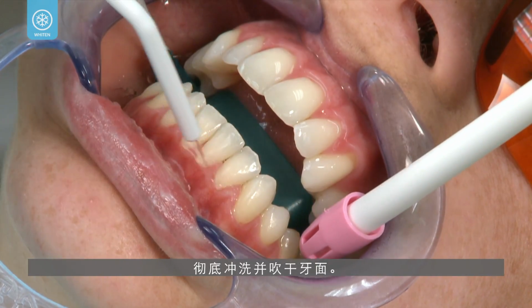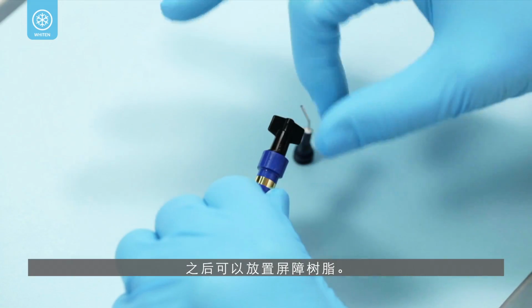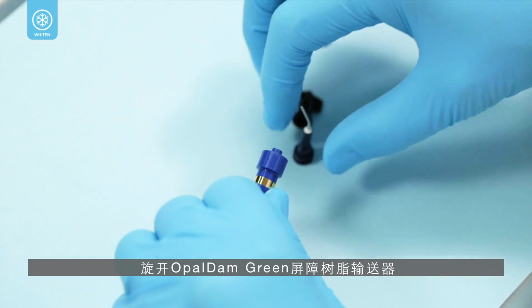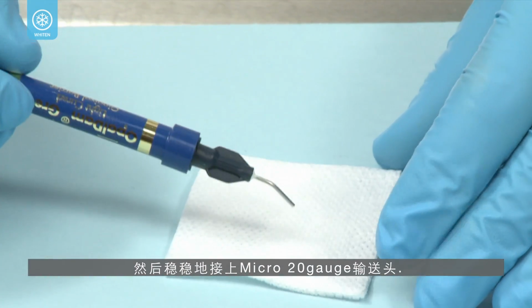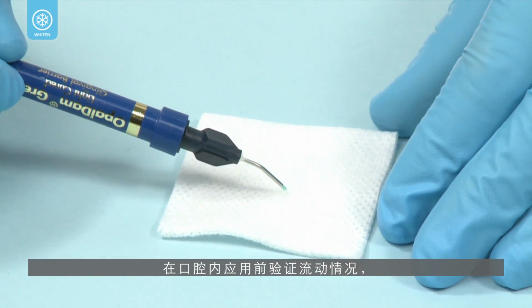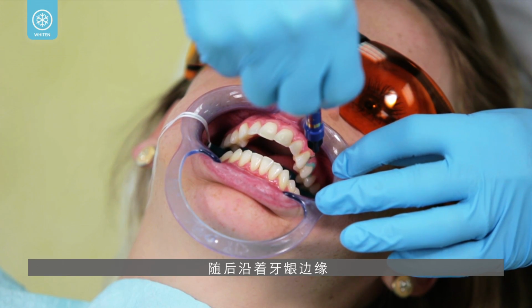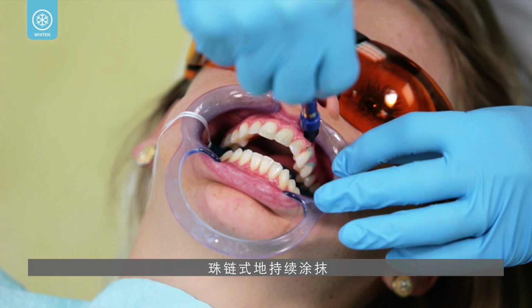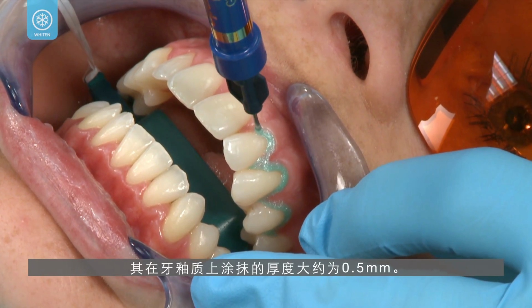Completely rinse and air dry the teeth. Now you're ready to place the resin barrier. Start by removing the luer lock cap from the Opaldam Green syringe and securely attach a Micro 20 gauge tip. Verify flow prior to placing intraorally. Then express a continuous bead of Opaldam Green along the gingival margin, overlapping approximately 0.5 millimeters onto the enamel.